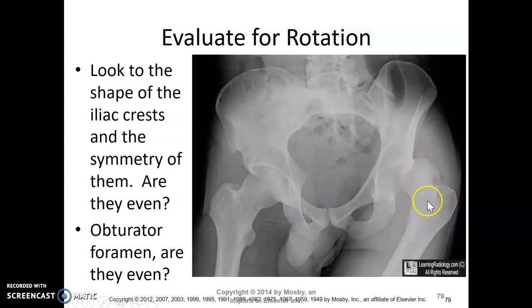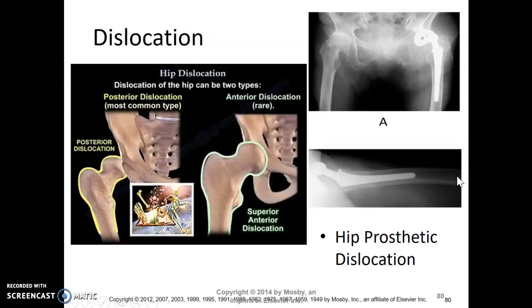Obviously, this femoral head is not where it's supposed to be, right? It's not in the right place. There's a lot going on in this patient's pelvis. But crack open that textbook. I want you to review how you evaluate for rotation.